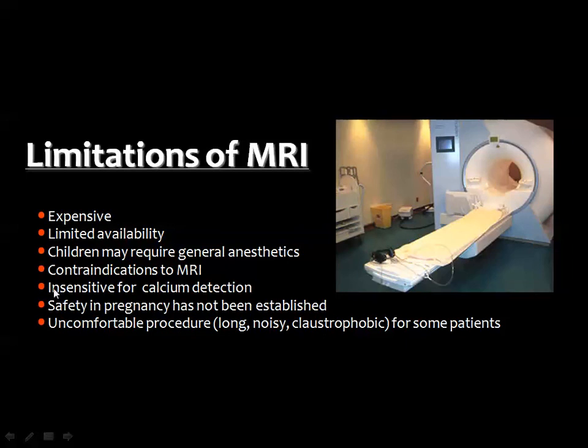And also, there are some contraindications to MRI. Some patients cannot perform this MRI, as I have mentioned. And also, MRI is insensitive for calcium detection. You will know the explanation of this in the lecture of MRI. MRI is not that safe in pregnancy. It is not hazardous, but it is not proved to be safe, especially in the early trimester of pregnancy. And also, the examination may be uncomfortable because of the long time and the noise produced by the machine. And also, the claustrophobic patients may suffer much from these closed machines.